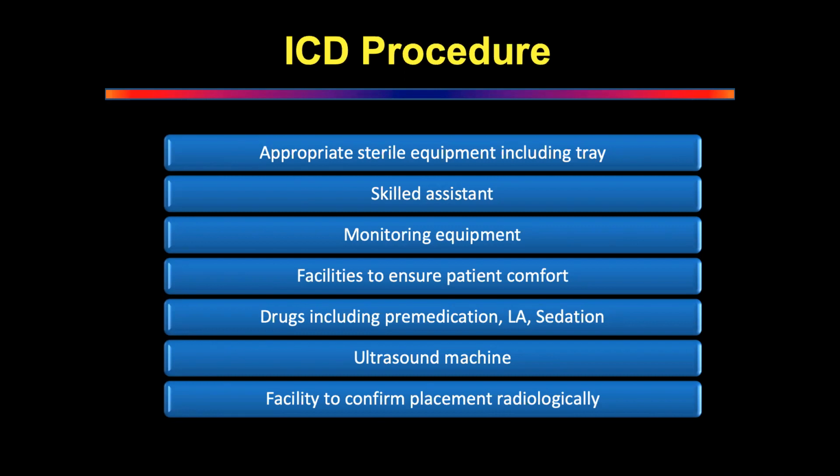It depends on the body build and weight of the patient. 14 French, if you are talking about an adult patient of whatever size. All the exam is about adults. This is not a pediatric exam, so stick to adults. I know you do pediatrics, but in the FRCS exam, just talk about adults. People don't know much about pediatrics. So what size?